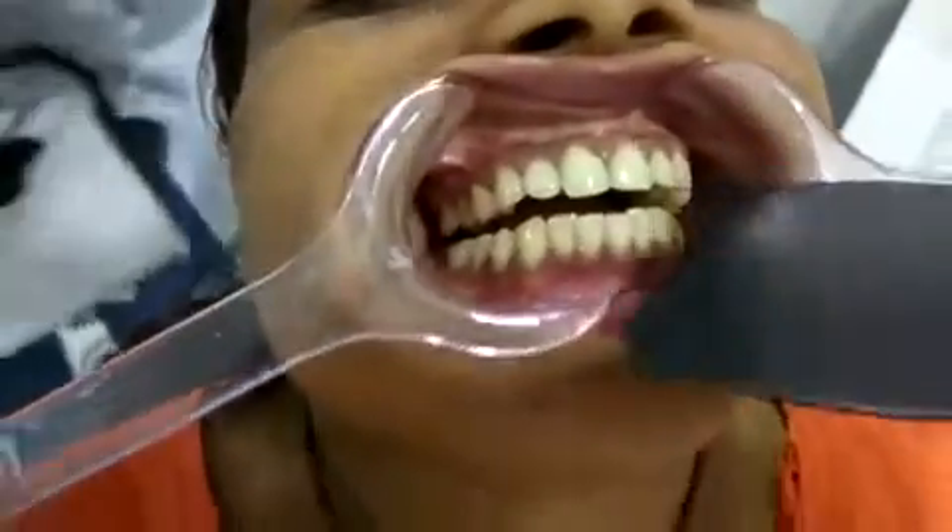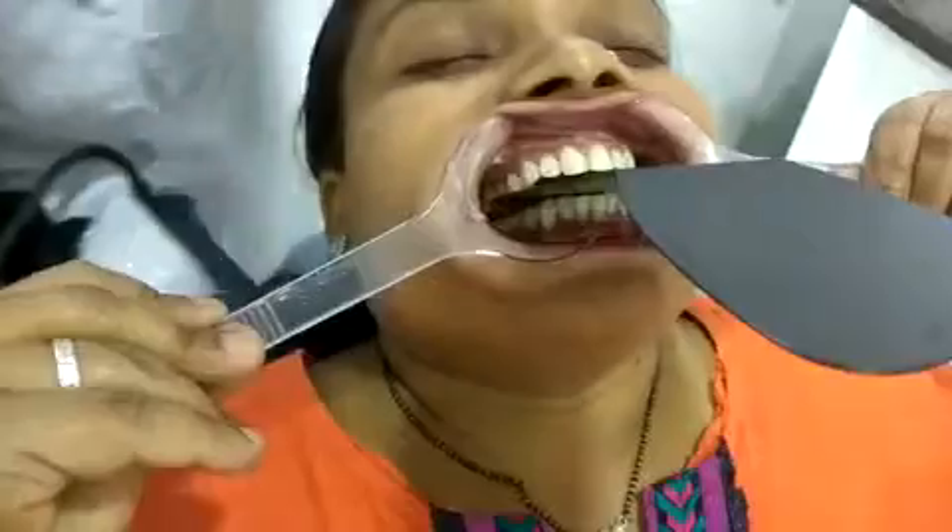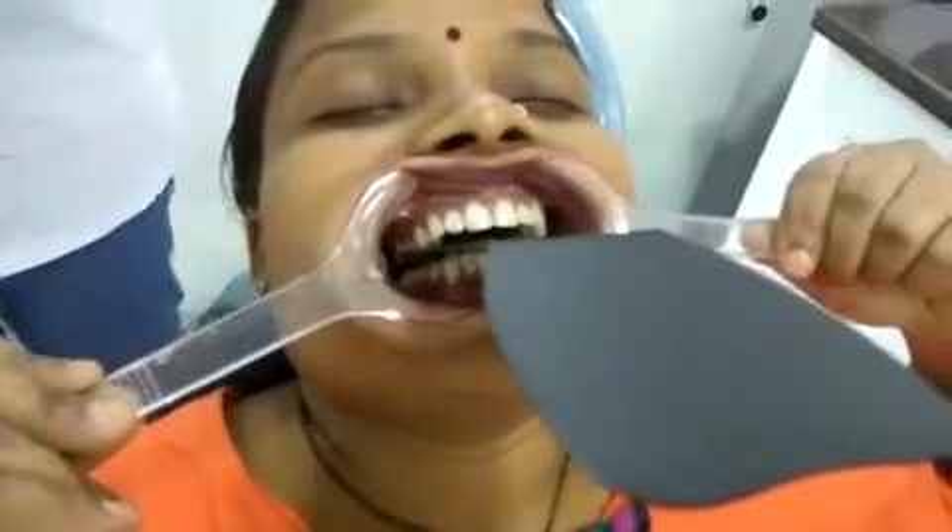Close your mouth slightly. The best way is to slightly go behind the patient and place the contrastor in. The best is to go behind the patient and take a picture so we have a both-retracted view. Just slightly take the cheek behind it so it's easy first.